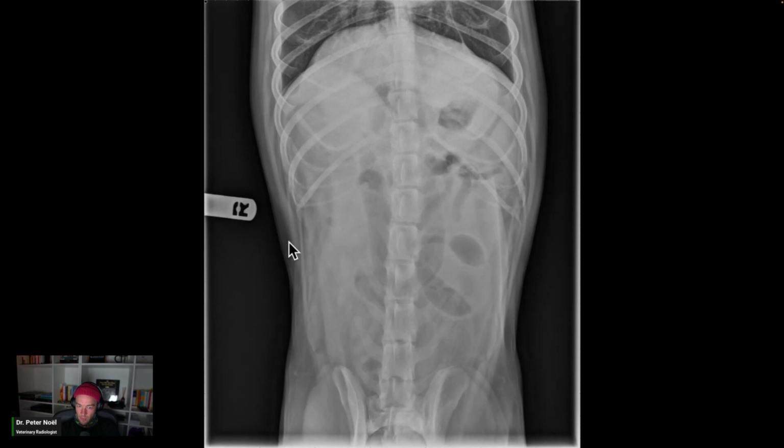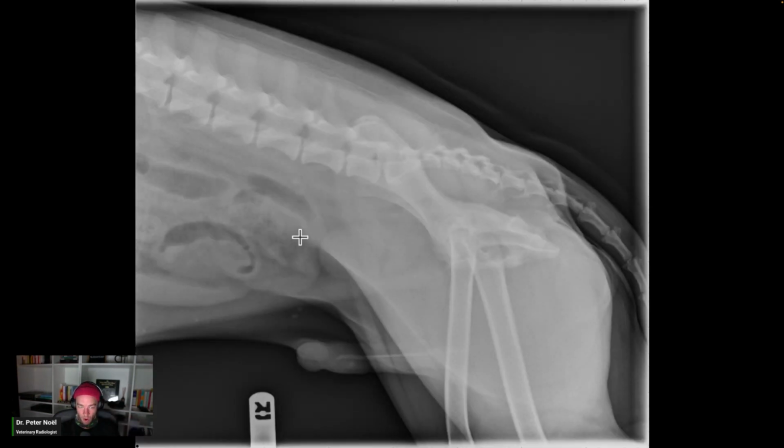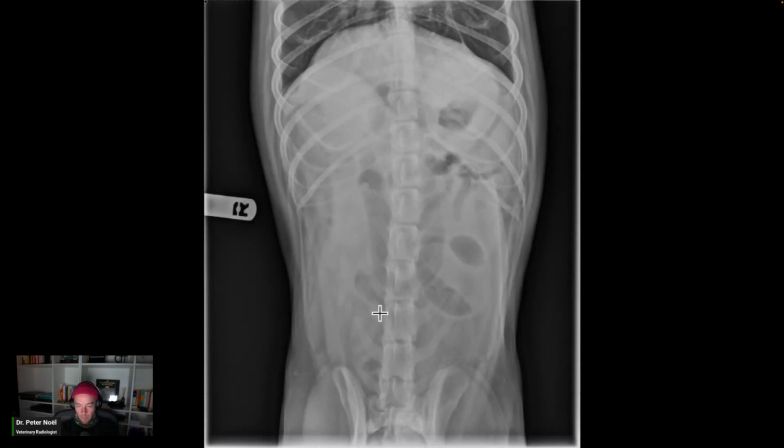Okay. If this was in the right abdomen, probably not, right? Because the descending colon pops out and it goes around here and then it comes this way, right? So if this was in the right caudal abdomen, you could say for sure not colon. It shouldn't be this far descending. Sorry. If it was in the colon and it's in the right side of the patient, it should be in the ileocolic junction, which stops at L2 to L5. So if there's something back here, it's not likely to be in the colon.